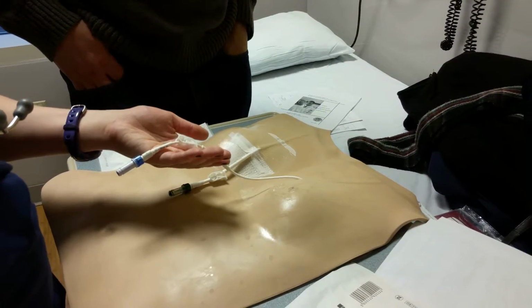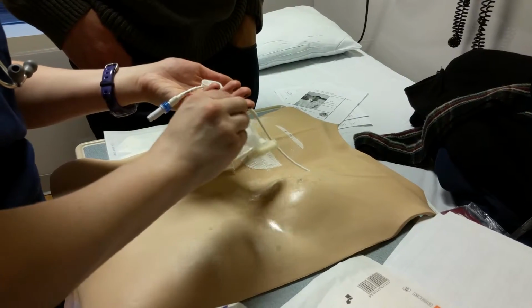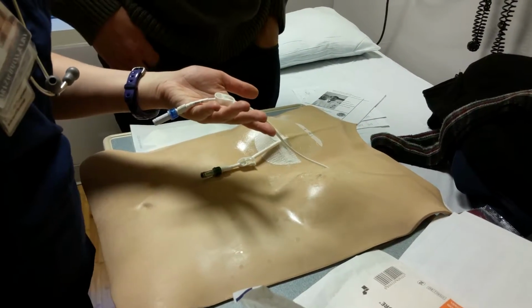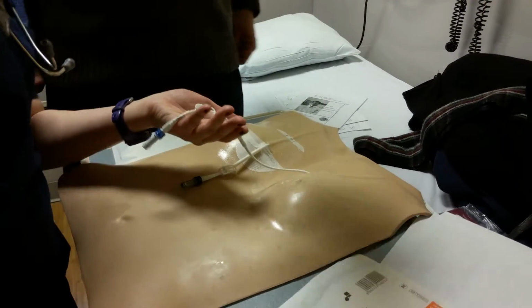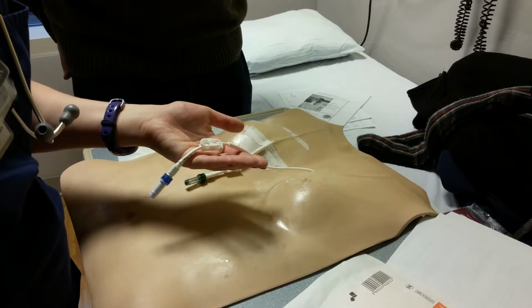We're going to wait a minute for this to dry, and if we've got a really juicy stick with a lot of liquid under here, maybe I'm going to lift this up to let the air hit it. I'm never going to do this or blow on it, because again, you're bringing stuff in that doesn't need to go in. So let's see.